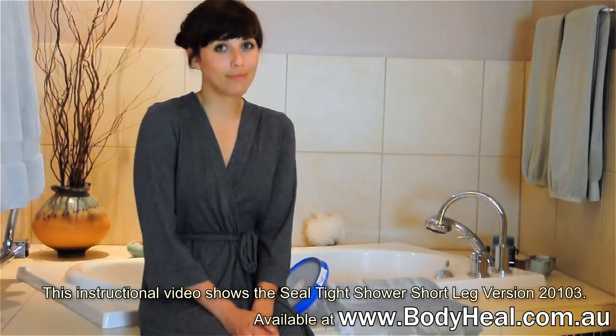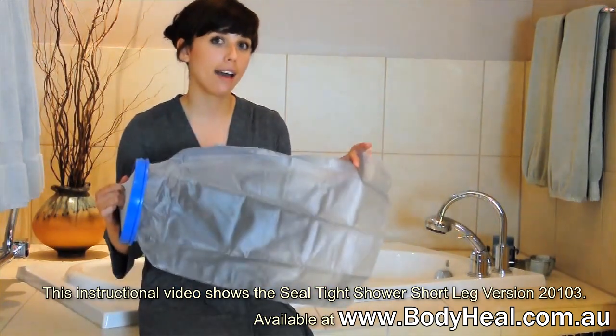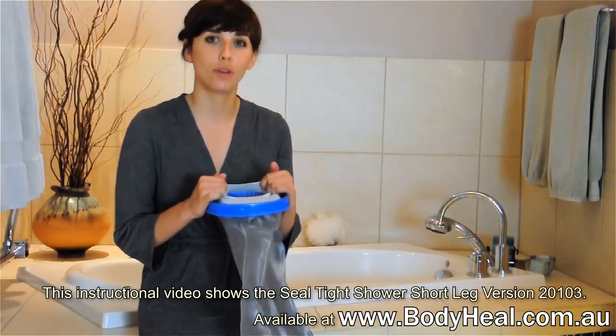Sensitive to latex? Sealtight Original has you covered. Instead of natural rubber latex, Sealtight is designed with a polyvinyl bag and non-latex diaphragm ring, giving you a snug fit above your cast while maintaining a waterproof seal.